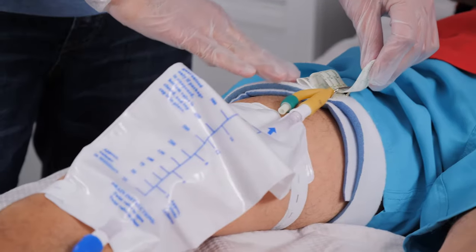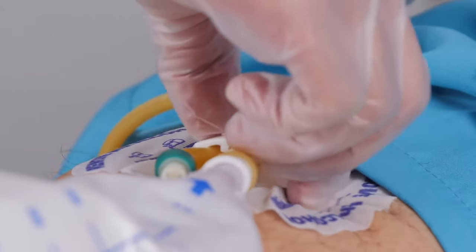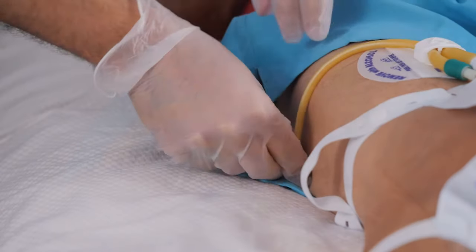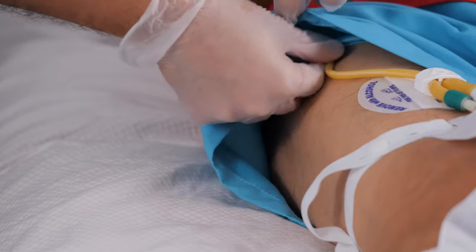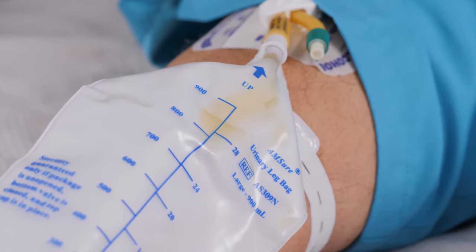There are a few ways to hold the tubing in place. Belts, stat locks, and anchors are some of the most popular. Whichever the person you're caring for uses, make sure the tubing isn't bent or kinked and that the urine is flowing into the bag again after you change it.